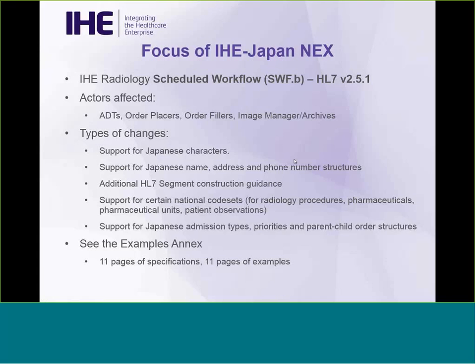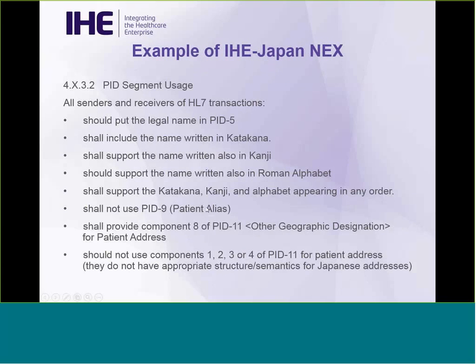It's often as much or more descriptive than the specification itself. So we're hoping that people will find that useful. And kudos to Salt for having worked through all of those examples. He manages the IHE Japan Connectathon for radiology, and so they're used to putting together these data sets for the Connectathon.